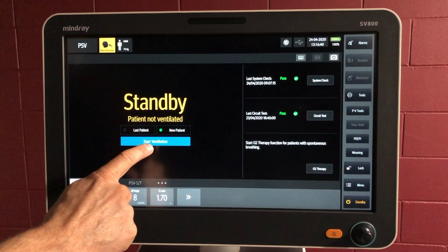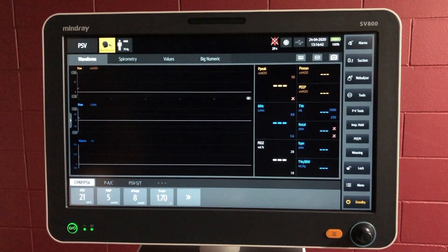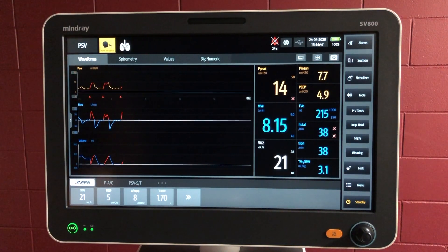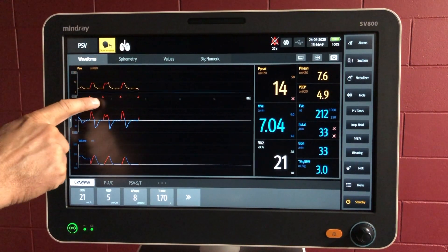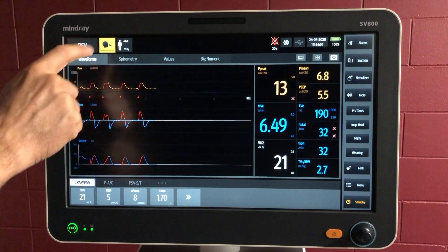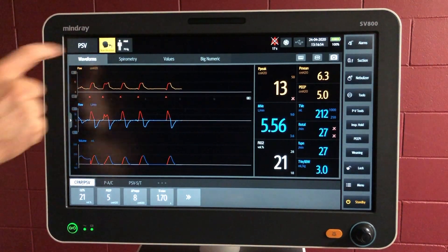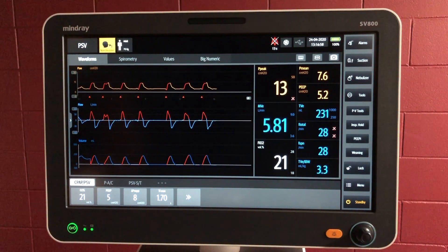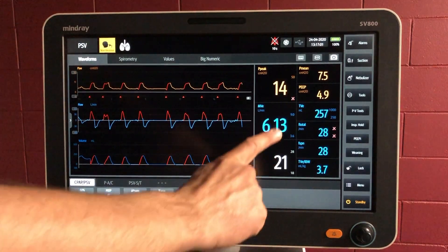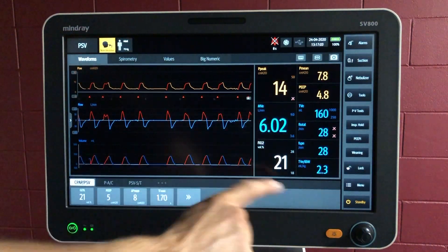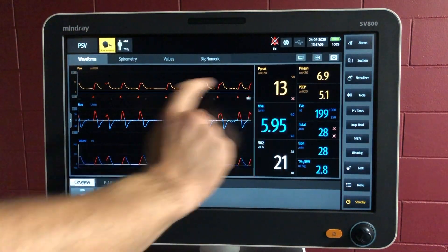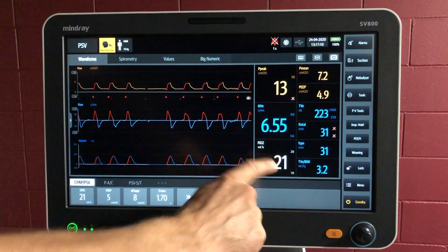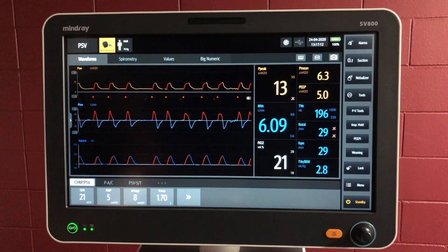So we can start ventilation now. When you see the patient take a breath, you'll see two things: you'll see the triangle here, and we'll see a lung symbol here as well. All of your readings are over here, all of your measurements are over here. The pressure ones are orange in this case, and the flow rates are blue, with FiO2 in white.